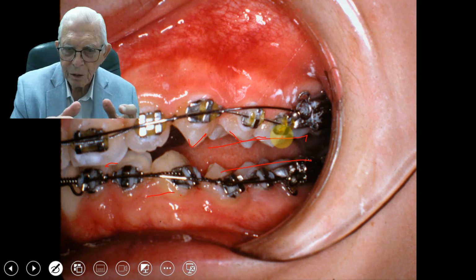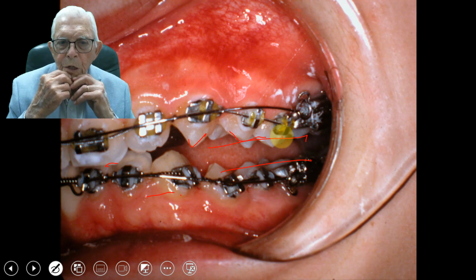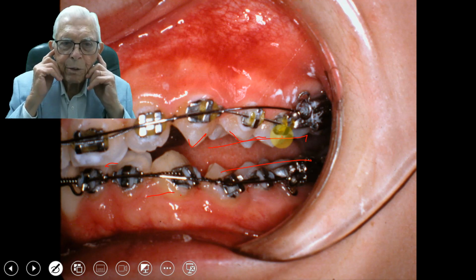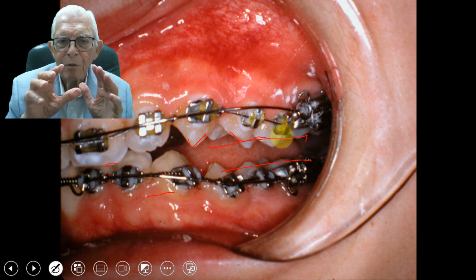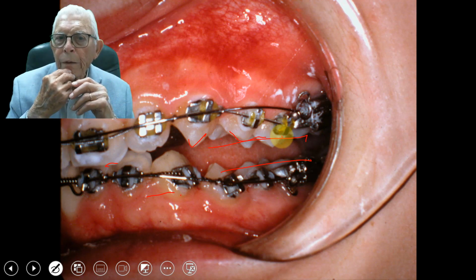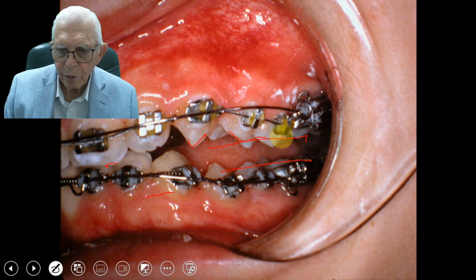And that's the same principle here. We brought so many jaws forward to relieve the TMJ problem till we decided just to use that to bring bottom jaws out, fill in the facial structure where someone has a retrognathic mandible. So that's what we're doing here.